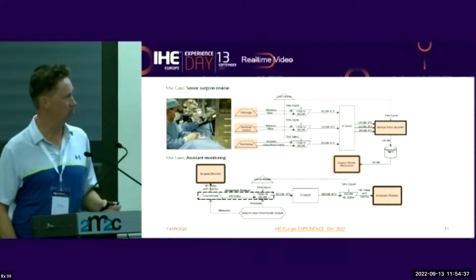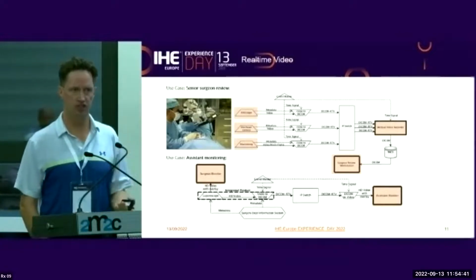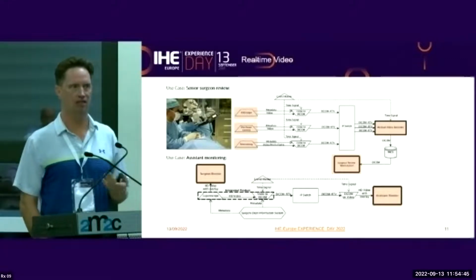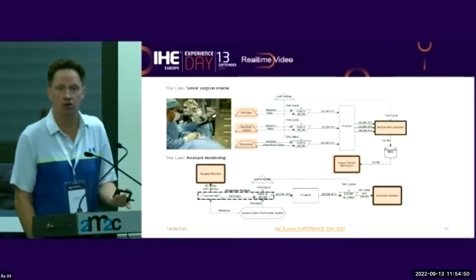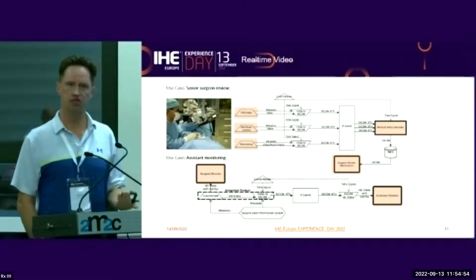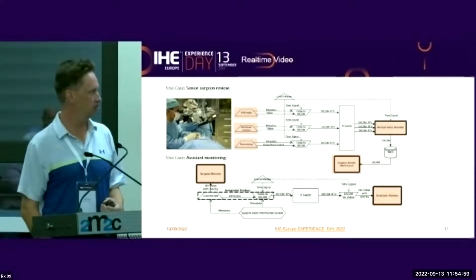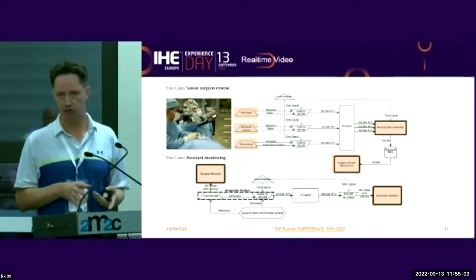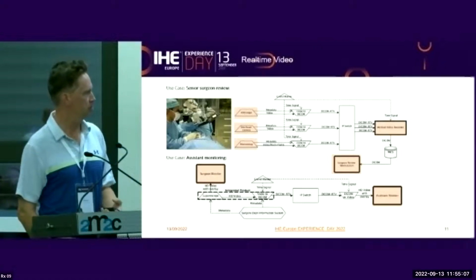And a typical example would be you perform a surgical procedure, and the patient one day, maybe 2 days later, gets really ill from the surgery, and you don't know what happened, what did we do wrong? And then you can take the recording, go to a surgery review station, and look at all the captured videos, and maybe you'll find out that something wasn't done exactly the way it should be, or that the patient had another problem or condition and so on.